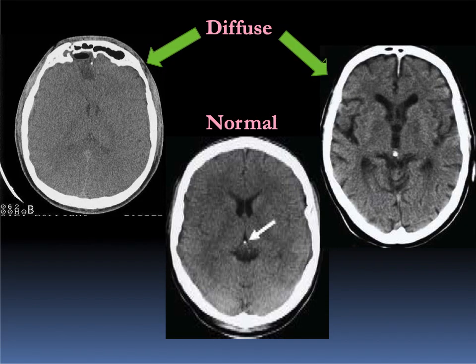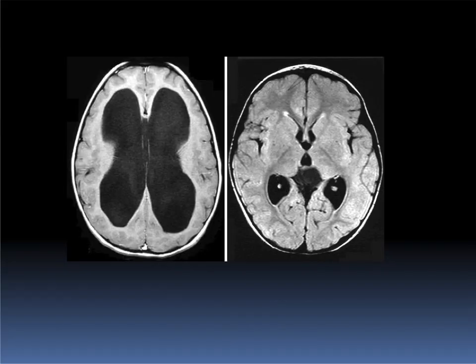This on your left is a diffuse lesion: the ventricles and sulci are effaced, that is diffuse disease, edema. On the right side there is atrophy with dilated ventricles and sulci and a widened Sylvian fissure. The midline is normal, and compared with the ventricles, on your right there is dilatation while on the left they are compressed.